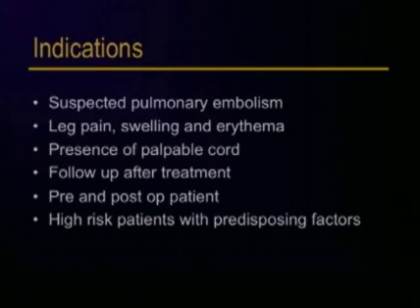What are the indications for lower extremity examination? Well, patients with suspected pulmonary embolism, those experiencing leg pain, swelling, or erythema, the presence of a palpable cord. Patients may have a lower extremity Doppler exam after treatment. Pre- and postoperative patients may also get the study, as well as high-risk patients with predisposing factors, as I indicated in the prior slide.